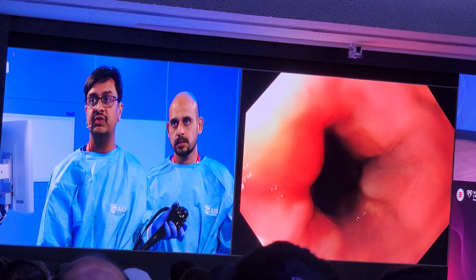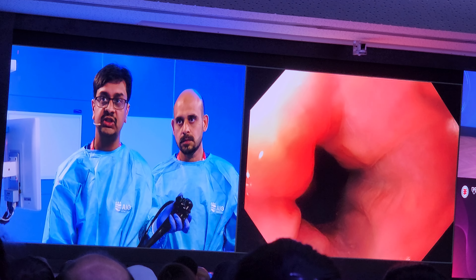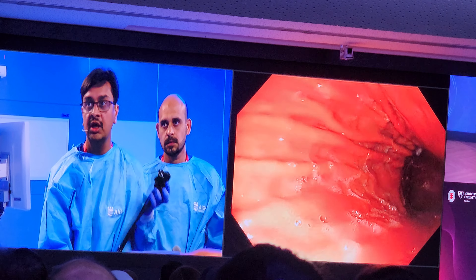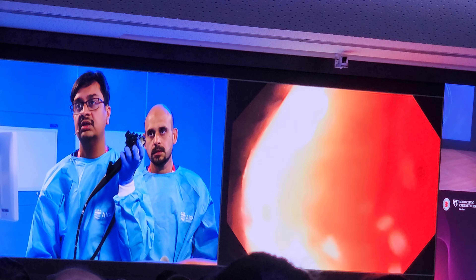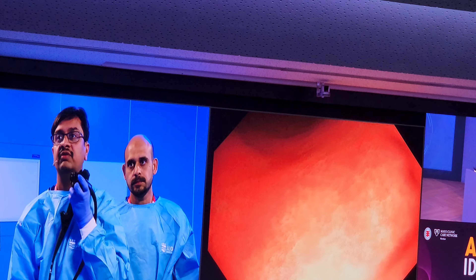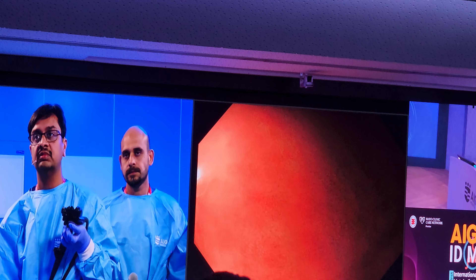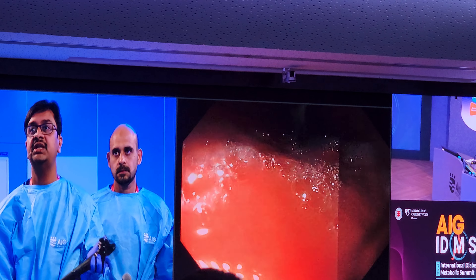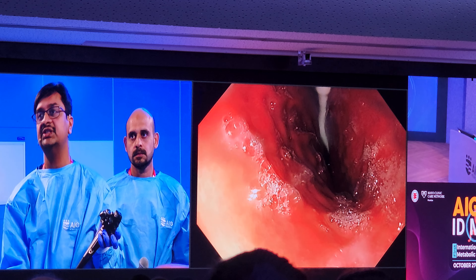We have reached the inside of the stomach. Here we look at the GE junction. I have already done a check endoscopy and there is no hiatus hernia. We go in till the antrum. Once we have reached the antrum, we can see the entire balloon inside the stomach.